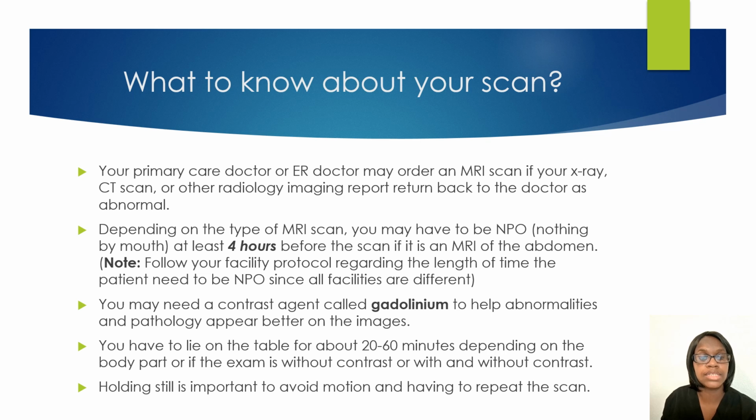You do have to lie on the table for about 20 to 60 minutes, depending on if it is with or without contrast, or depending on how the facility has their MRI sequences and protocols set up. So holding still for the patient is very important to avoid motion and having to repeat the scan. So you want to make sure that you are relaying those instructions to the patient to hold still.